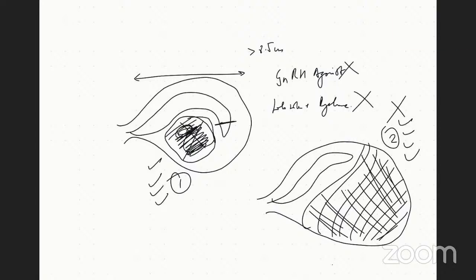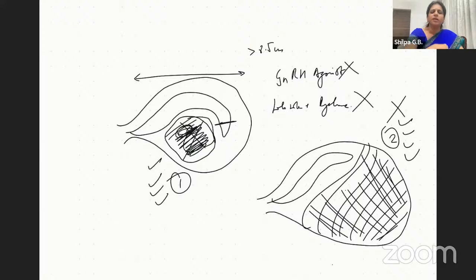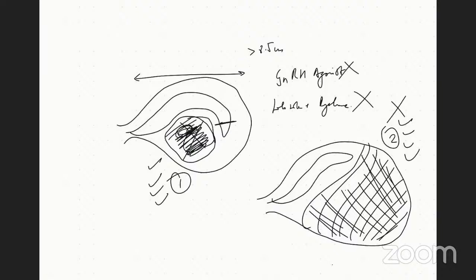And see these huge uteruses, case number 2, the type you mentioned. You think, that's such a big uterus. If you do microwave ablation, are you really going to enhance or conserve fertility potential in such cases? What is your thought? See, it will act the best in case number 1, madam. That also I will tell you. It will act the best in this case.